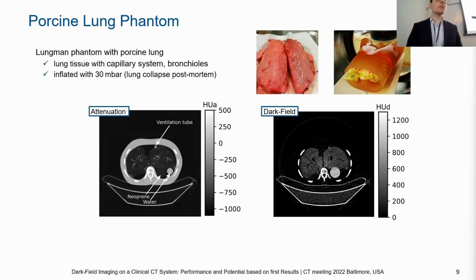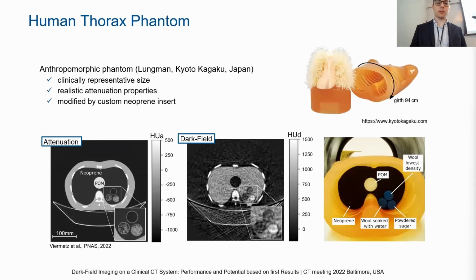Hi, thank you. Very nice talk. I'm wondering if you can comment on how, for example, the patient's motion, like the cardiac and breathing, will impact the image quality. Yes, so I guess it's like in any CT imaging that of course it's not that great. However, regarding motion, I can maybe show you this image here again.